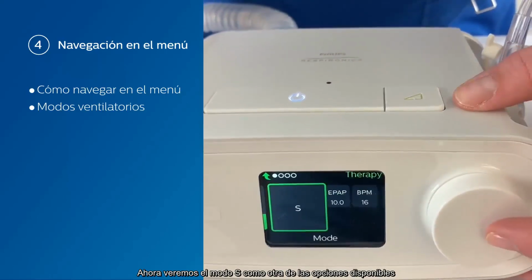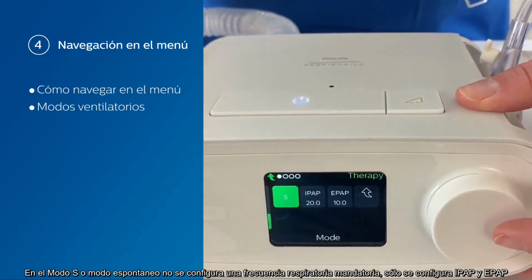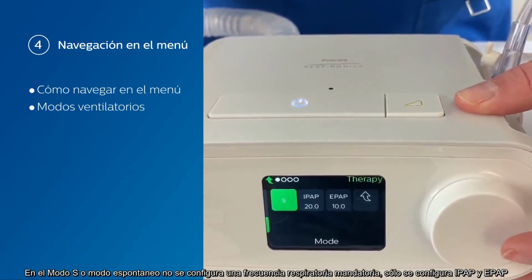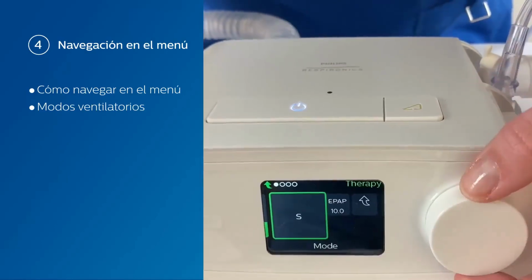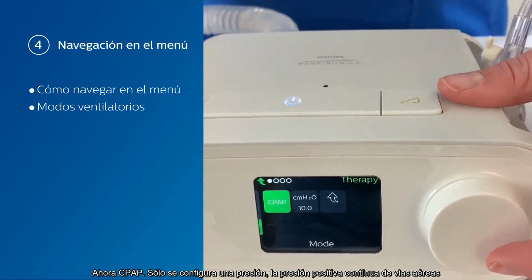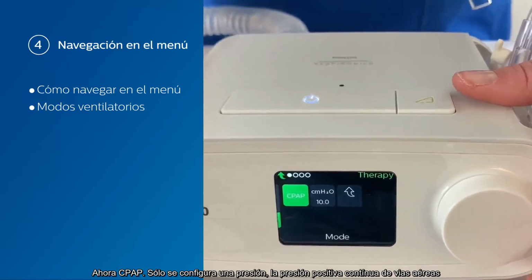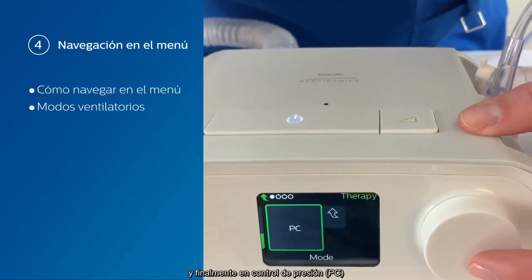We're going to go through S mode. That's another one of the options here. In S mode, that's a spontaneous mode where you don't set a mandatory rate, you just set an IPAP and an EPAP. Now CPAP. In CPAP, you only set one pressure. That's your continuous positive airway pressure. And finally, pressure control.